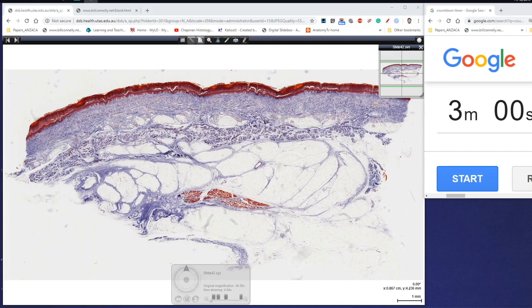Hello everyone, Jamie Chapman here for another episode of 3 Minute Histology. In this video we're going to be looking at dense connective tissue, and in particular we're going to be focusing on dense irregular connective tissue.